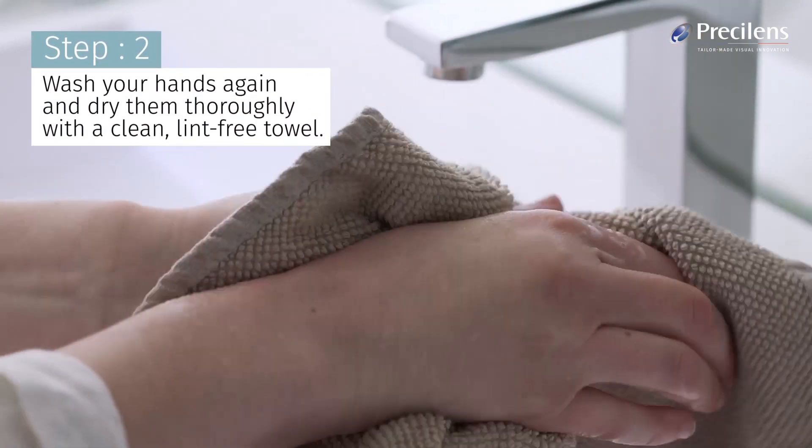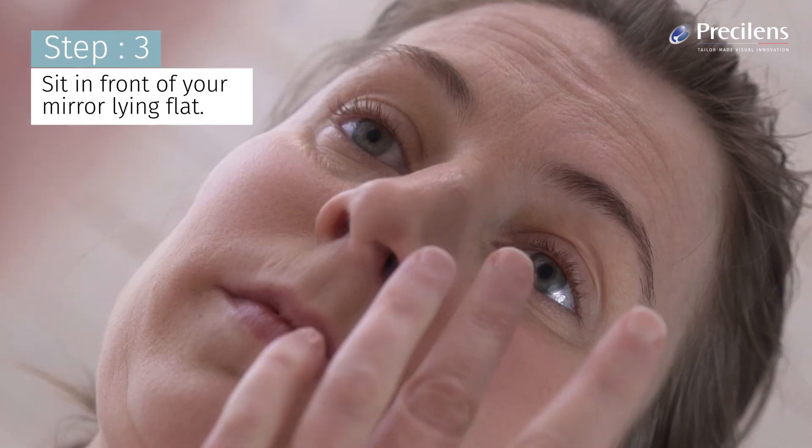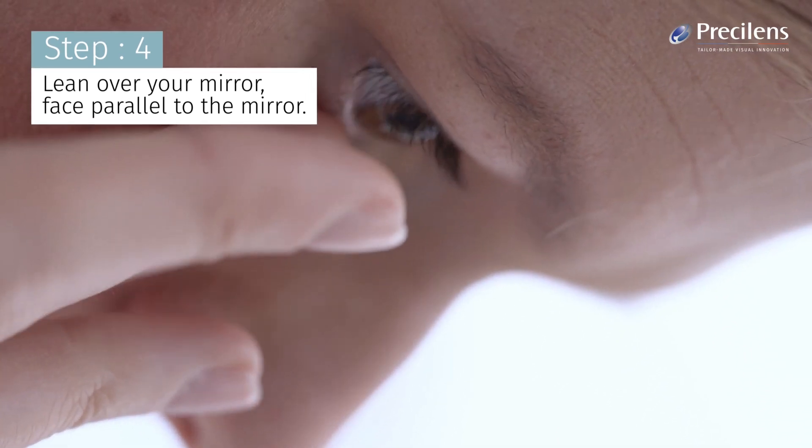Wash your hands again and dry them thoroughly with a clean, lint-free towel. Sit in front of your mirror, lying flat. Lean over your mirror, face parallel to the mirror.